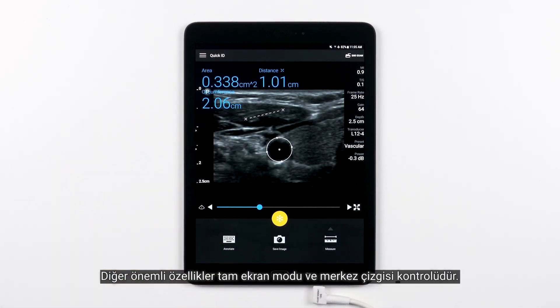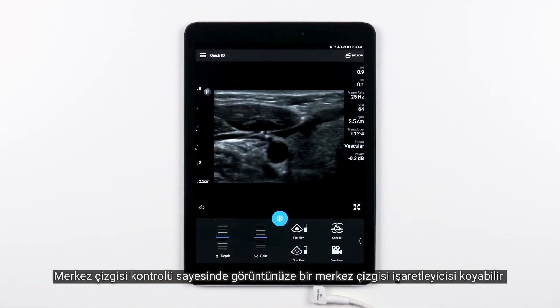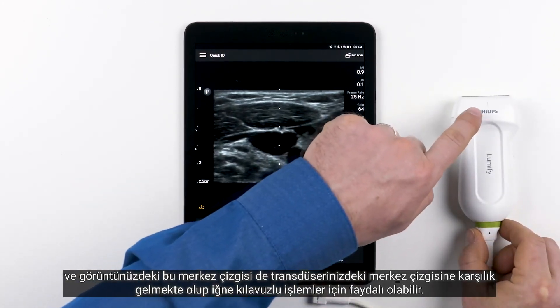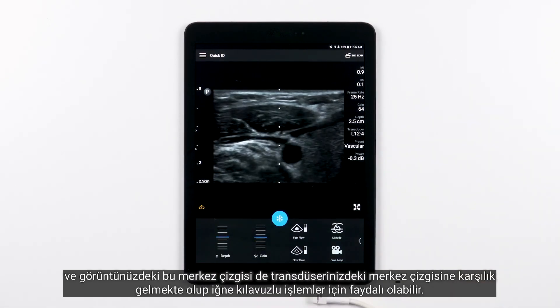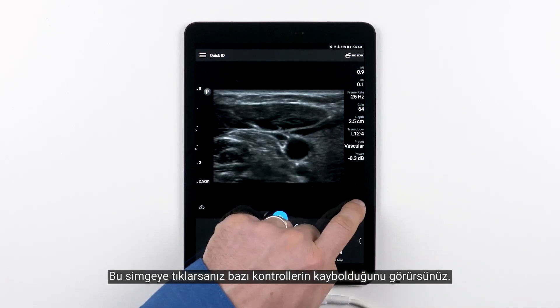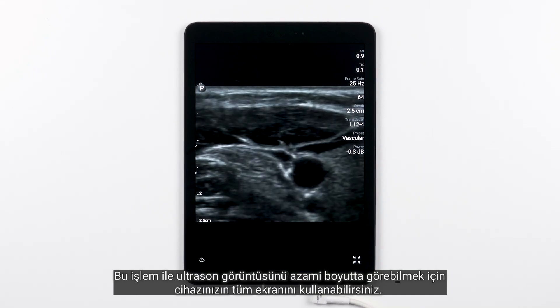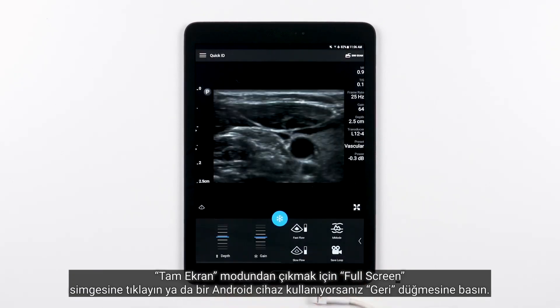Other important features are the full screen mode and the centerline control. These controls are available regardless of whether or not the image is frozen. The centerline control allows you to place a centerline marker on your image, which corresponds with the centerline on your transducer and can be useful for needle guidance procedures. In the lower right-hand corner, you'll see the full screen icon. If you tap that, you'll see some of the controls disappear, giving you the ability to use your device's screen to view the maximum ultrasound image. To get out of full screen, simply tap the full screen icon or hit the Back button if you're using an Android device.